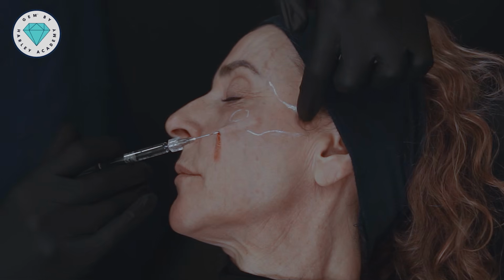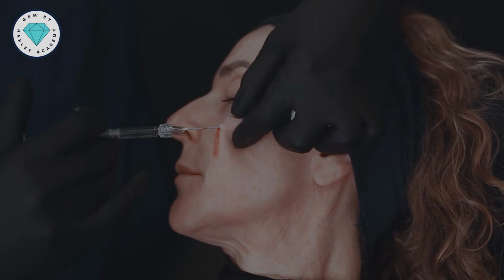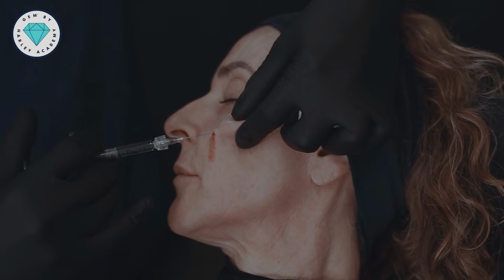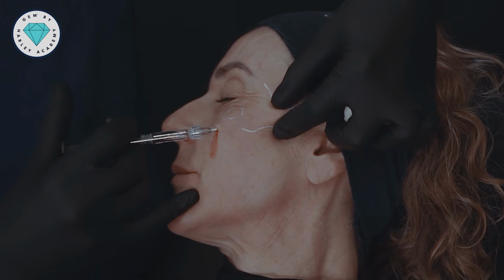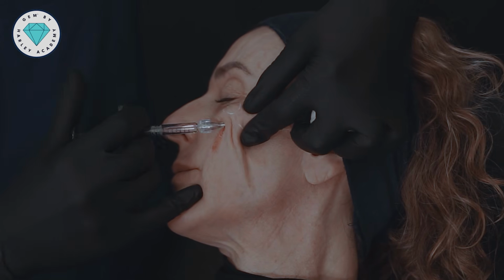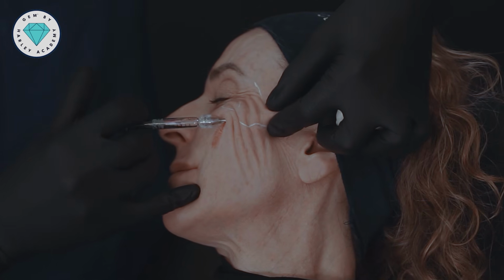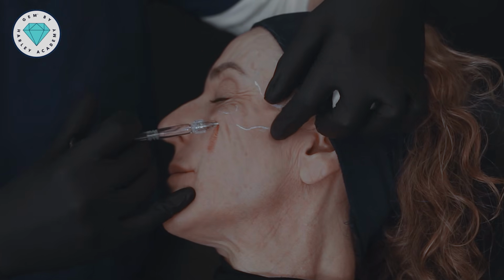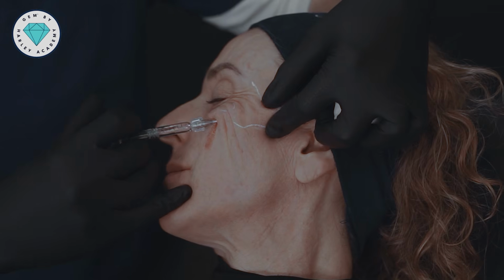I don't need to start treating the deep plane until I get to this point, where I'm going to again perforate through the orbicularis oculi muscle, and now I'm moving in the deep plane along the lateral zygoma, the zygomatic arch. The reason I'm choosing this deeper depth is because, again, this is about deep volumizing, and I want to create as much structure as possible so that it enhances my medial midface treatment.